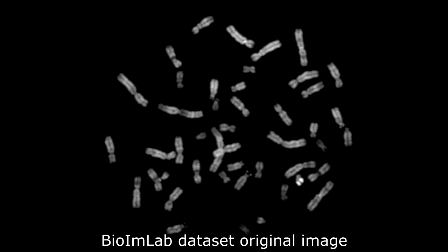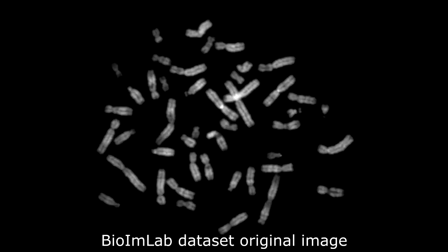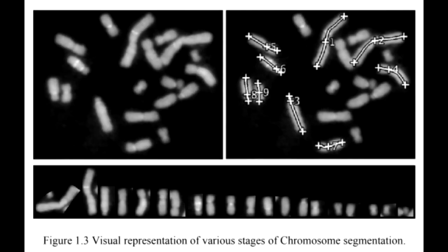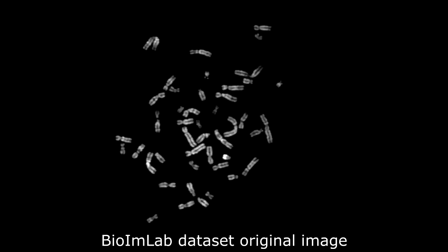After we obtain the metaphase images of the chromosomes, they are pre-processed in order to be made suitable for segmentation. Pre-processing generally includes refining and enhancing of boundary lines and adjusting the brightness and contrast of the image so that it is most suitable for the segmentation process.